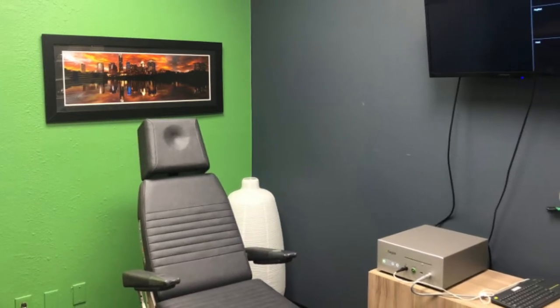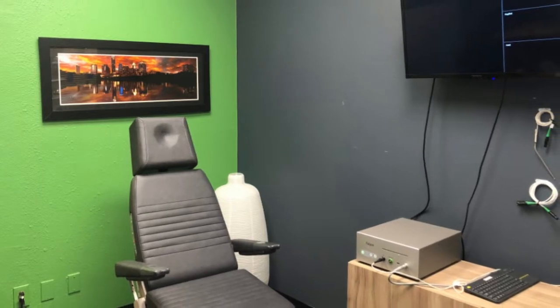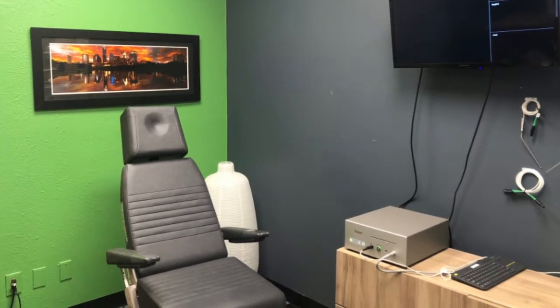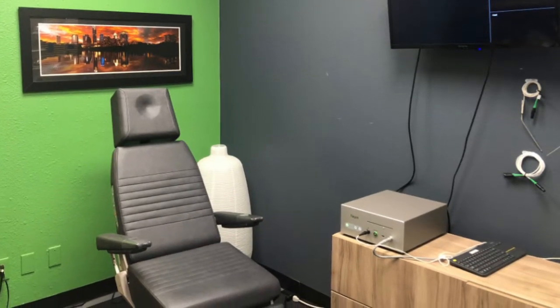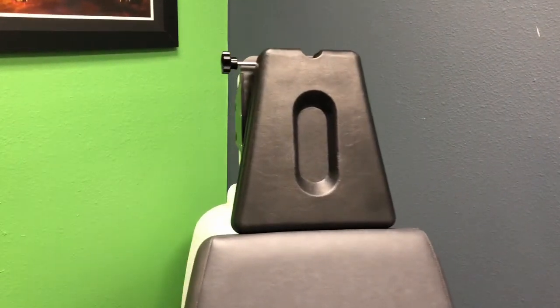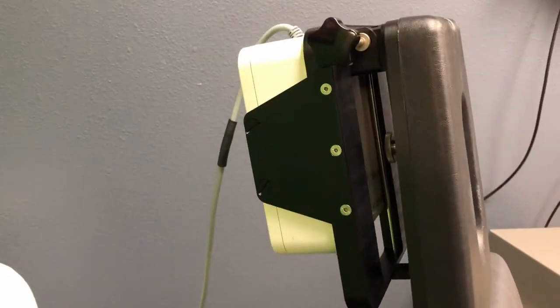In preparation for the patient registration process and the navigated procedure, it is important that the patient, as well as navigation components, are positioned correctly to enable optimal performance of the navigation system. In this first example, the Fiagon Universal Office headrest is used, which integrates the field generator into the headrest.